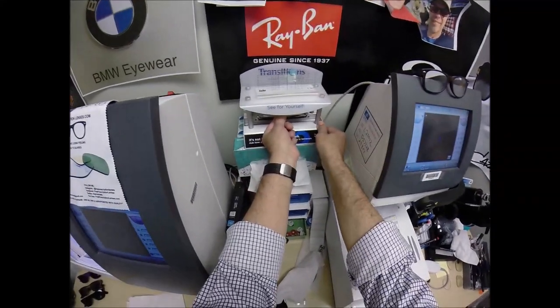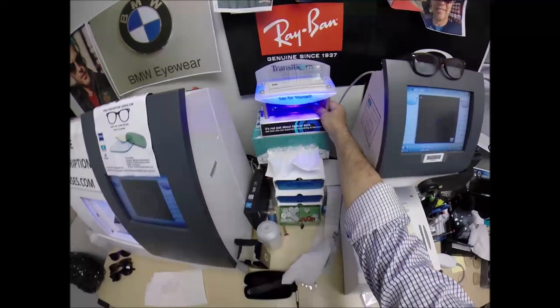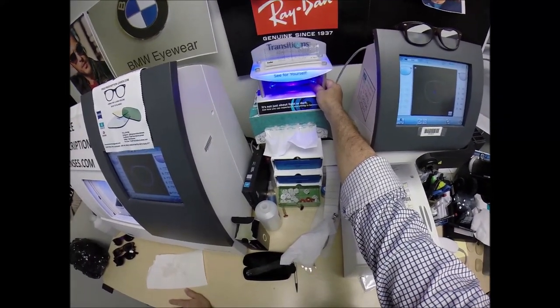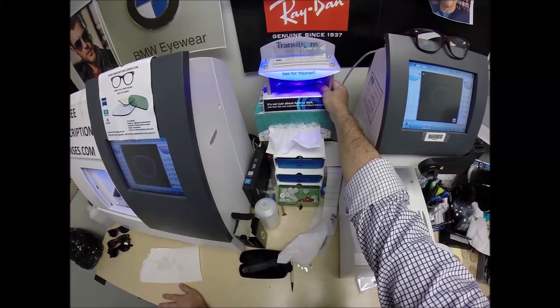And as you can see, turn on the UV light, and it takes about 30 to 45 seconds for photochromic transition lenses to darken. A little bit longer when you come back inside, 45 seconds to a minute, a minute 15.